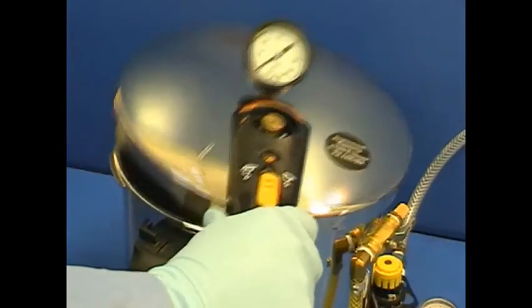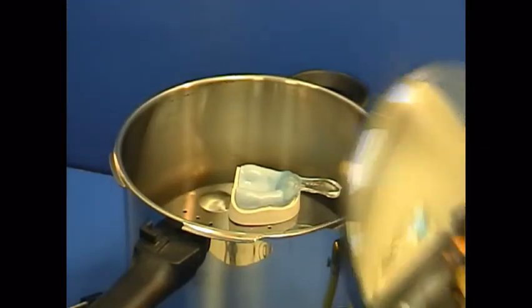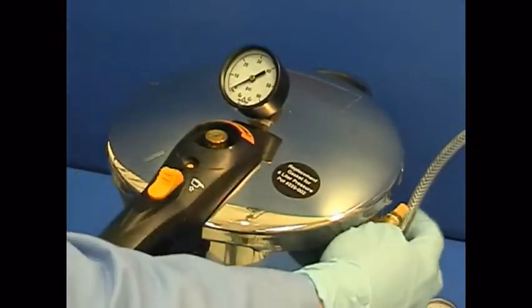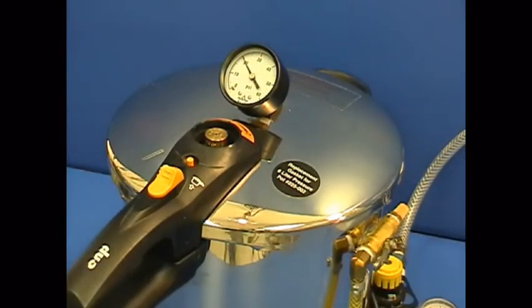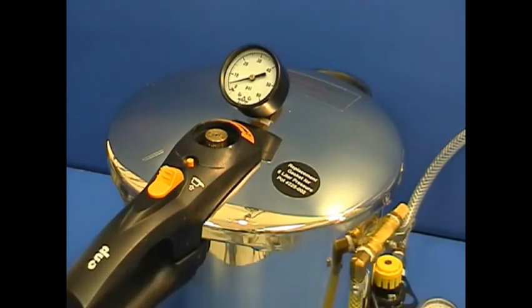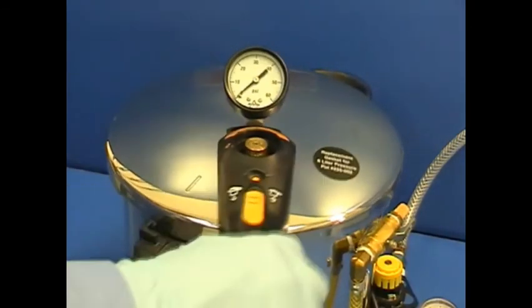Place the model, tray, and handle into a humid pressure pot for 15 minutes. The pot's pressure is approximately 20 psi and water temperature about 120 degrees Fahrenheit. Do not submerge the device in water. Evacuate the air pressure from the pot, then open the pot's lid and remove the cured tray and handle.